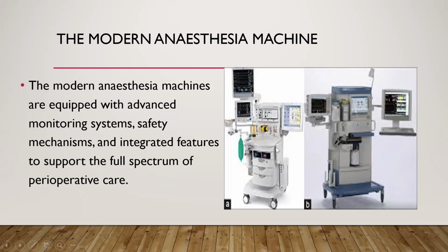They are all electronic flow meters now, and you just see it. It's amazing how technology has advanced the anesthesia machine. So the modern anesthesia machines are now equipped with advanced monitoring systems, safety mechanisms, and integrated features to support the full spectrum of perioperative care.